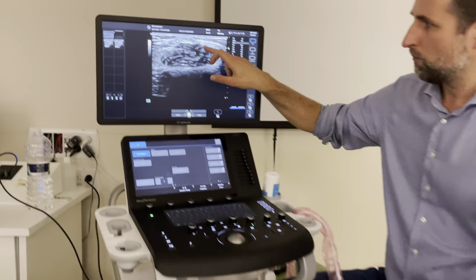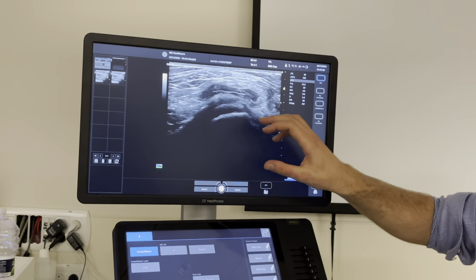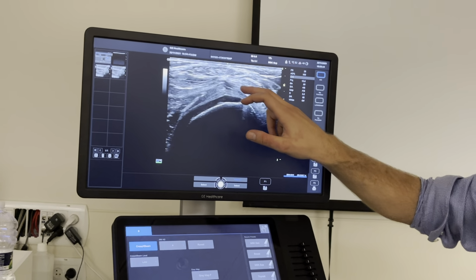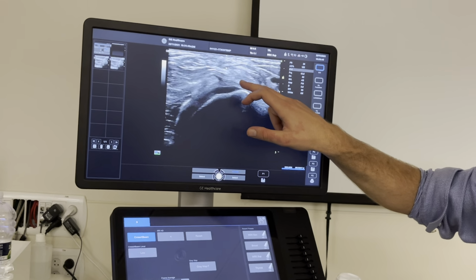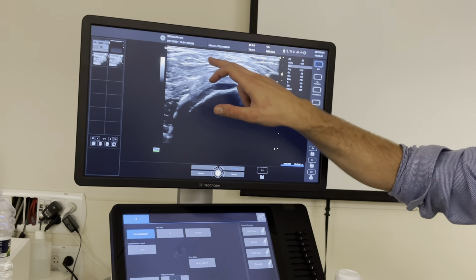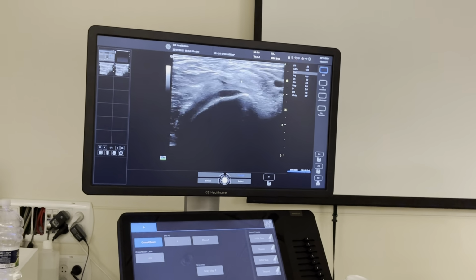We keep this in the middle of our image, and then we follow this one distally. And then we see that the semimembranosus muscle becomes smaller. You see it becomes smaller, smaller, smaller. And now this here is the tendon of the semimembranosus. This is the tendon still of the semimembranosus, this is semitendinosus. And here, in the depth, we see very clearly the cortical bone line on the dorsal side of the femur, with the femoral cartilage above it. So that's a very nice, this is actually a very nice image.